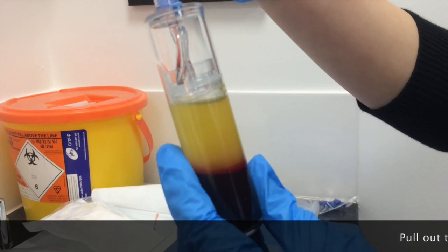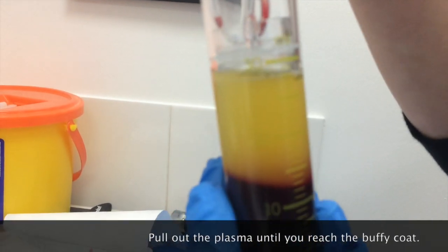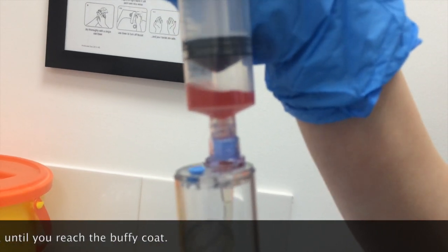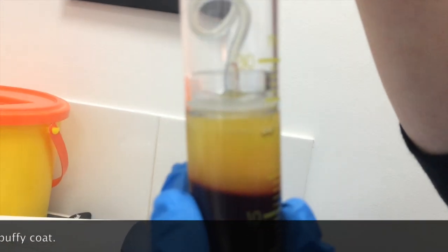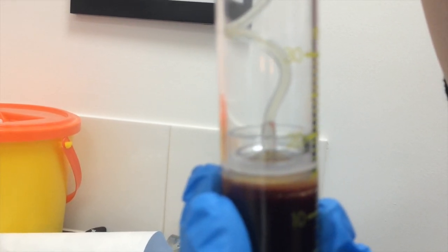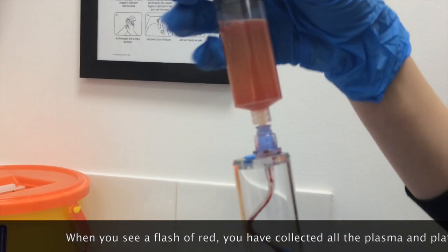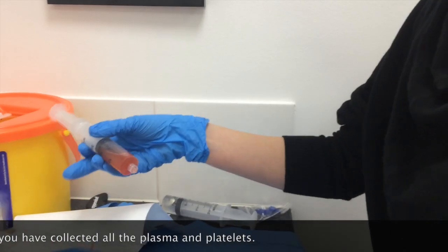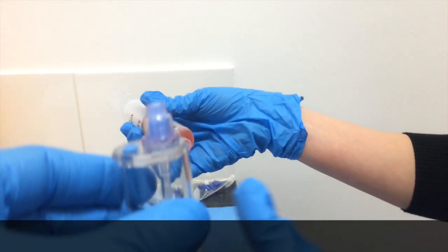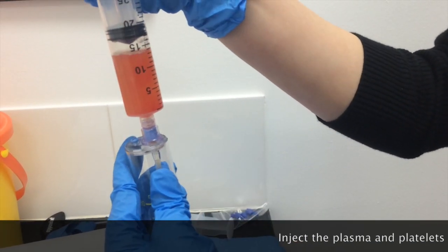Okay, now start to pull that plasma. The diaphragm is coming down, pulling the plasma up into the syringe. It's a little pink because there was a little blood in the tube from when you put it in. Keep going until you see that little flash — to make sure you get those platelets. There you go, that's good. Now unscrew it. You got that flash but the blood all stayed in the tube. Now we'll see on this tube — you don't have the diaphragm. So it looks a little different.